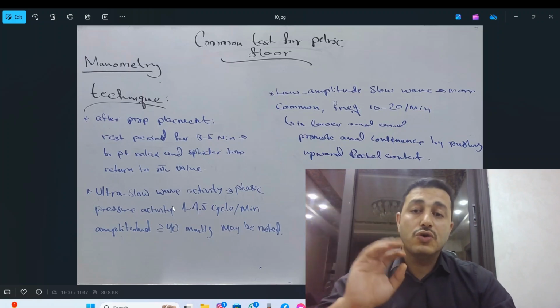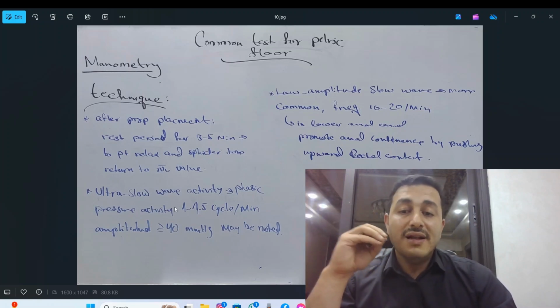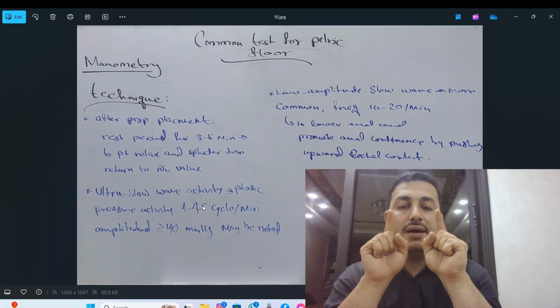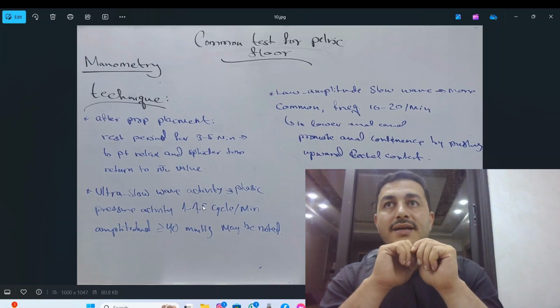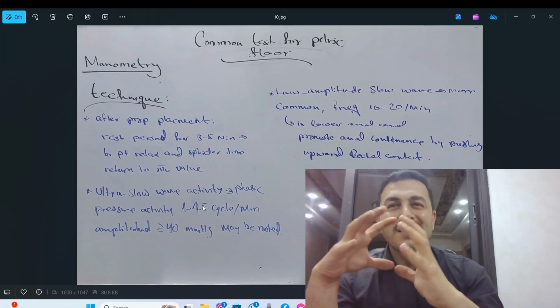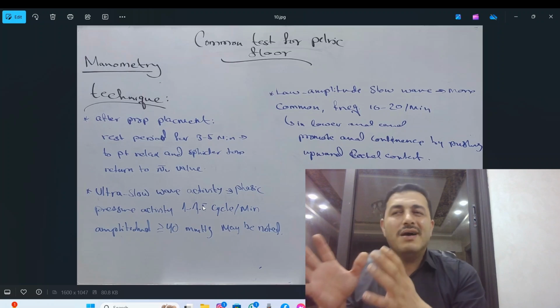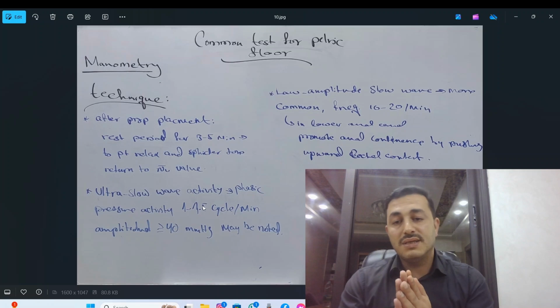This is seen upon insertion or as the first detectable wave activity. The ultra slow waves are less than 1 to 2 cycles per minute, while the slow waves are up to 10 to 20 waves per minute. Ultra slow waves are of unknown significance, more common in males, and may be associated with other diseases, but not with high sensitivity and specificity.